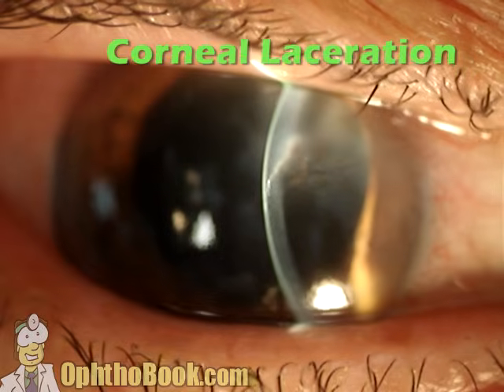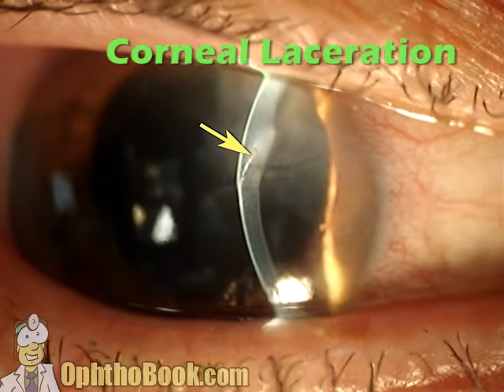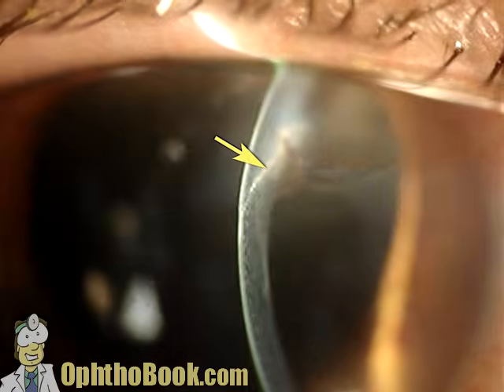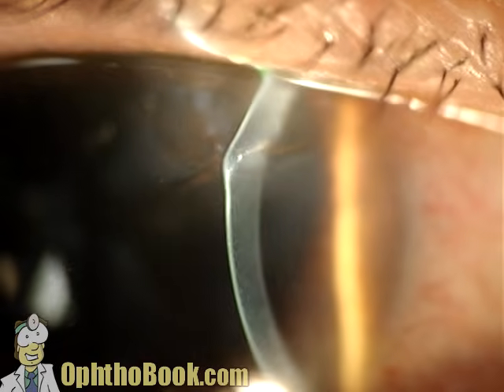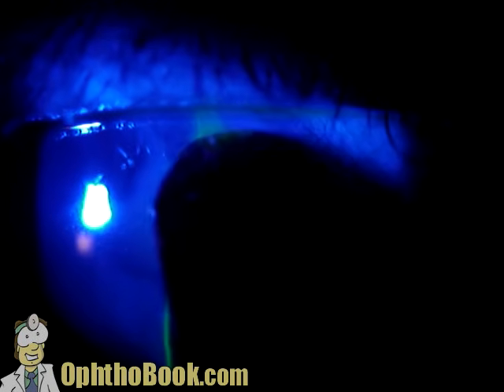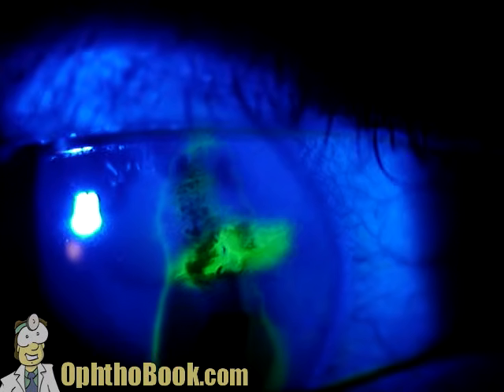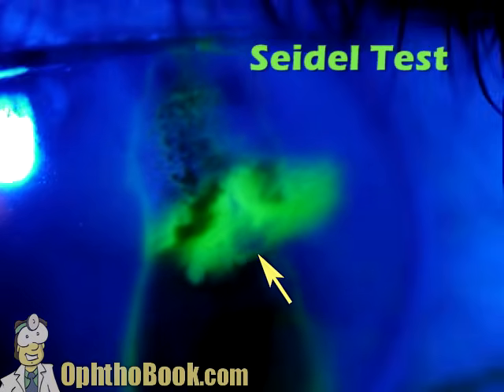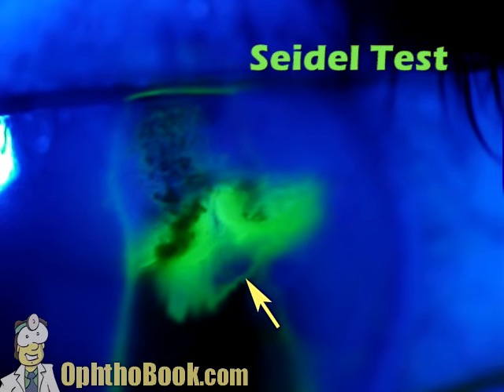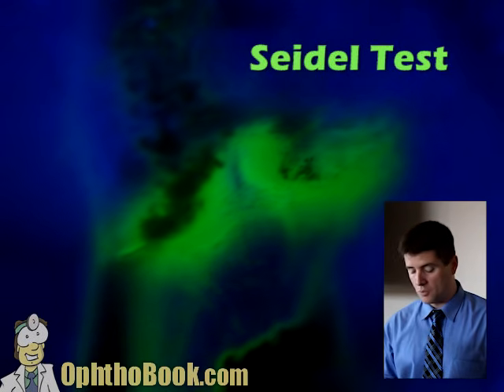This is a patient who has a corneal laceration, a nail through the eye, and we know it's a laceration because if you look at that, you can see a line going from the front of the cornea to the back. The question is, is it leaking or not? It's hard to tell just looking at it. So what do we do? We rub some fluorescein on the surface, and you look for leaks, and this is a fluorescein strip, and you can see that leak right there where the fluorescein is being diluted, and it's very obvious. This is the Seidel test. This is a Seidel positive test, and you have to be careful. There is a much higher risk for infection.